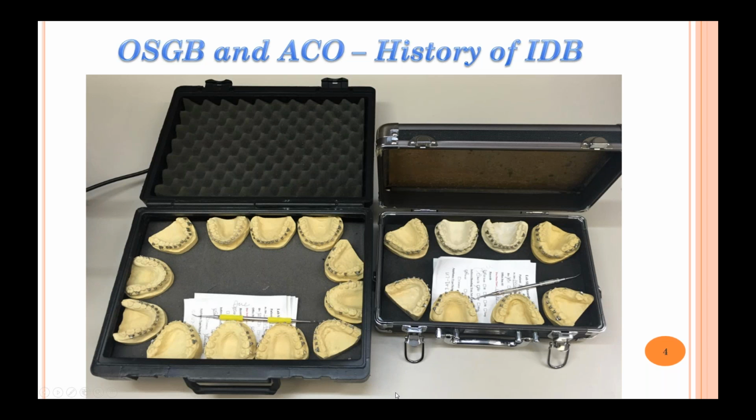You never complain about something like this, because there are 10 full cases starting up here, and that's a ton of production. But the issue is, I also know there's a ton of work I have to get onto, because you want the adhesive to start setting up, getting tacky on the models. So I probably have at least an hour, maybe an hour and a half of work to get all these models done.